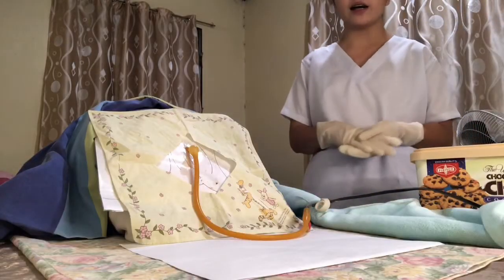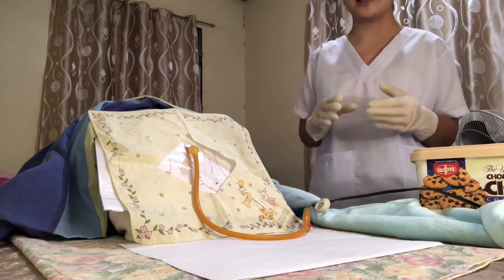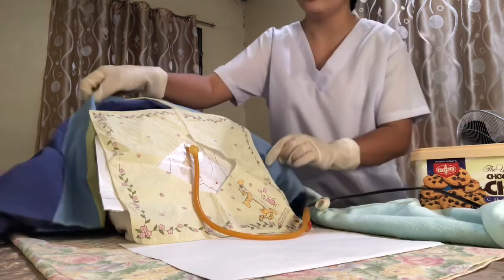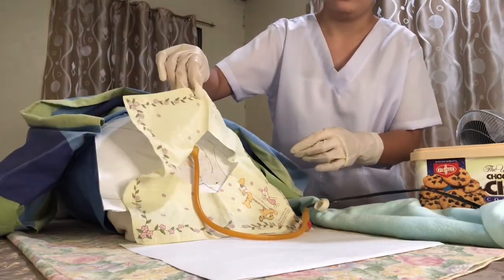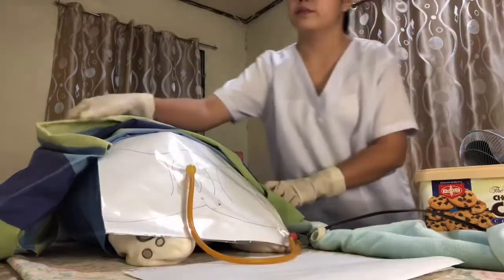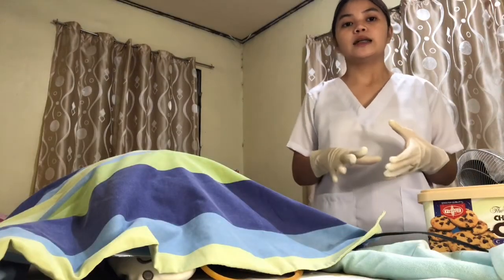So after that, place the patient comfortably. This fosters relaxation and comfort. So are you comfortable, ma'am? Okay. So after that, do aftercare of the unit and equipment used. The rationale for this is cleaning the environment promotes comfort to the client.